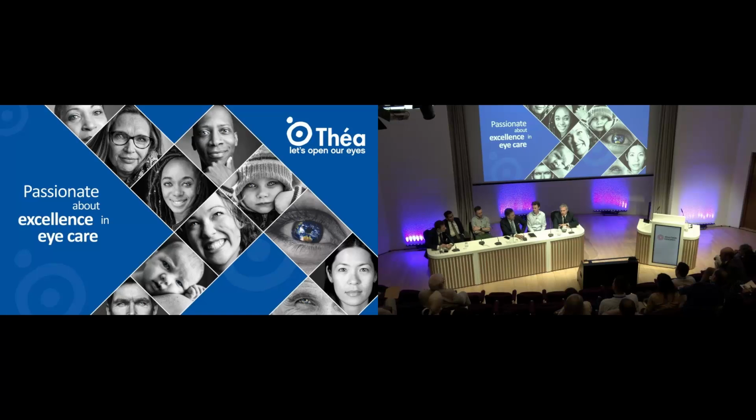Now, on that subject, there are papers extolling that diffractive optics can be used after corneal refractive surgery, and they can. But you don't even have to do the study to know that if you have aberrations on the cornea, and you're putting a lens with a lot of aberrations in it, you're increasing aberrations. You're decreasing light transmission, and you're decreasing contrast.